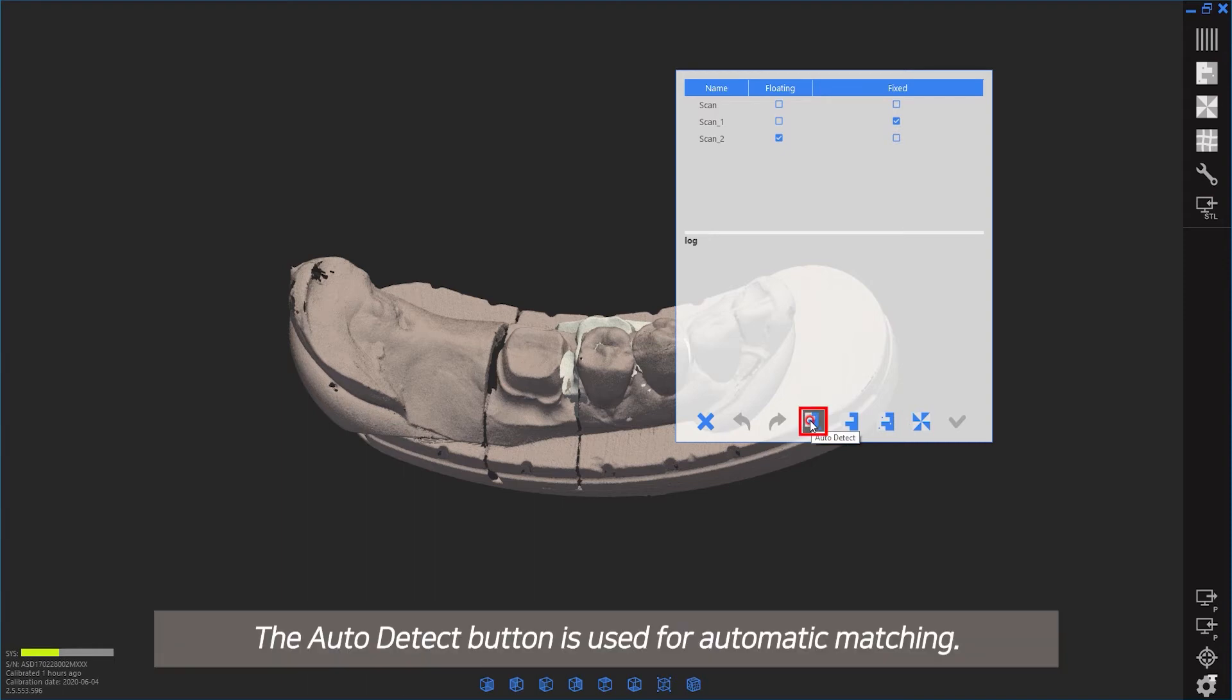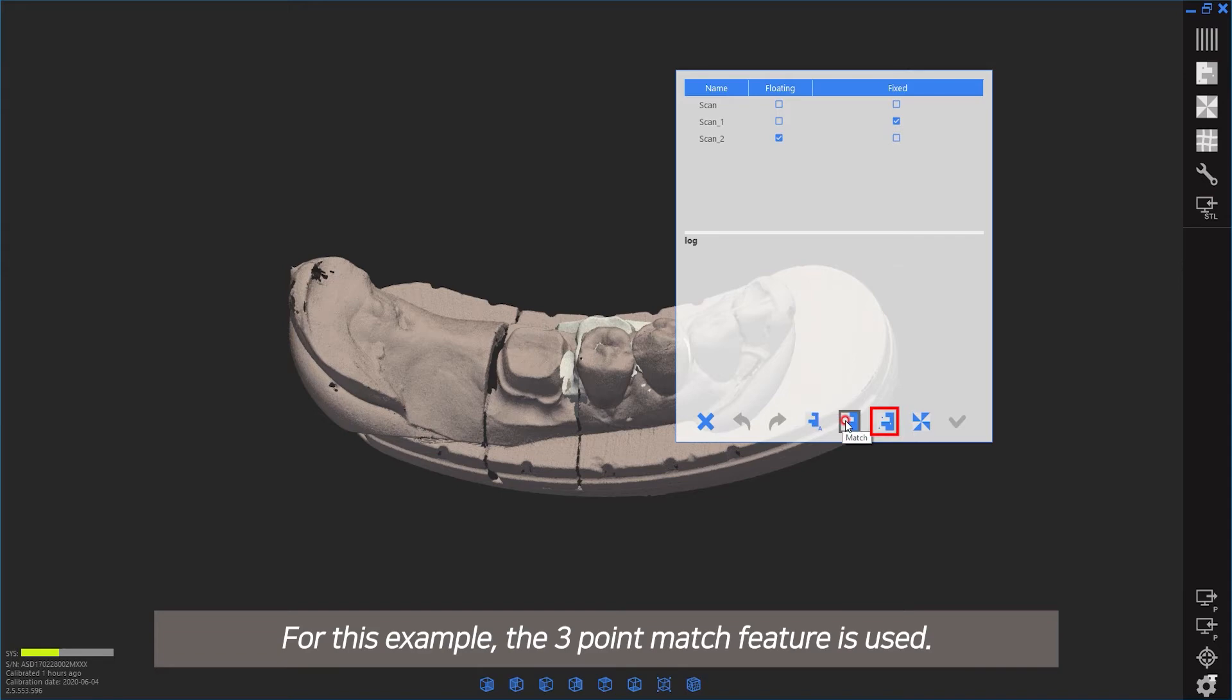The auto-detect button is used for automatic matching. For this example, the three-point match feature is used.